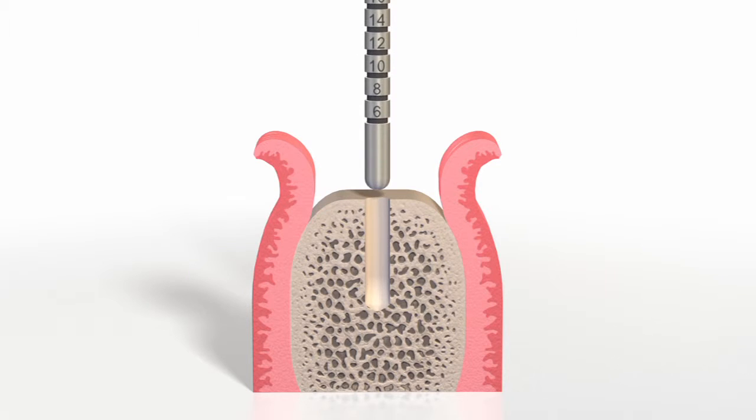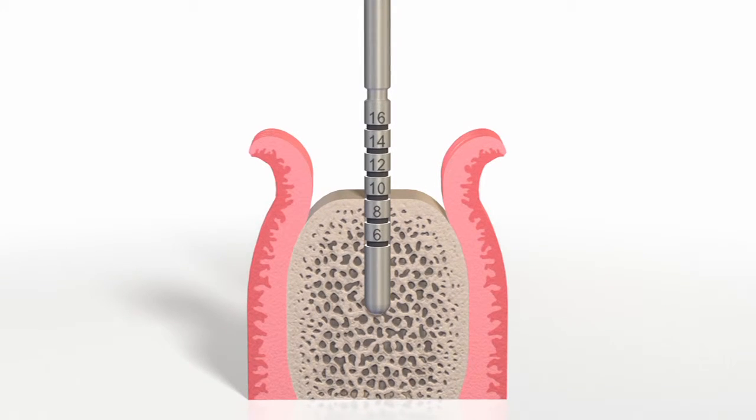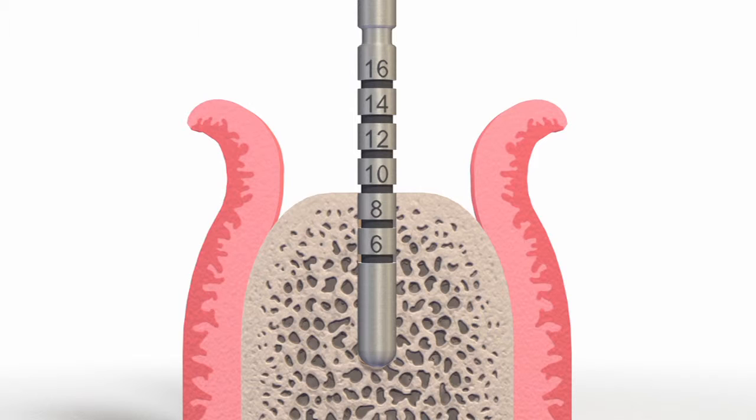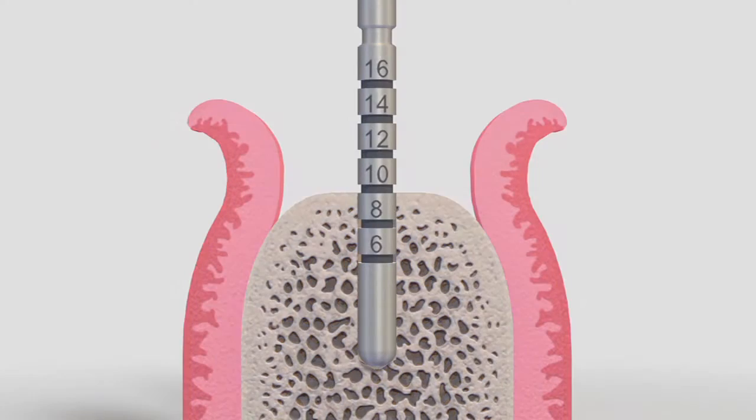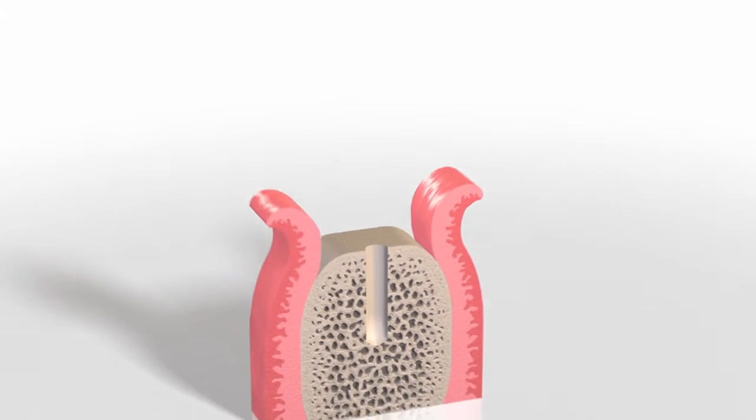Next, the 2.2 millimeter alignment pin is used to verify the implant axis and preparation depth. At this point, an X-ray should be taken, particularly with vertically reduced bone availability. The alignment pin is introduced into the drilled area, which allows the drill hole to be visualized in the context of the anatomical structures.